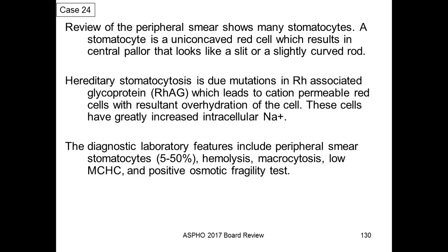So diagnostic laboratory features include a peripheral smear with a lot of stomatocytes, usually more than 5% is a minimum, hemolysis, macrocytosis, a low MCHC, and a positive osmotic fragility test.